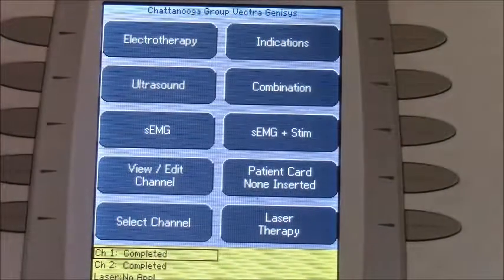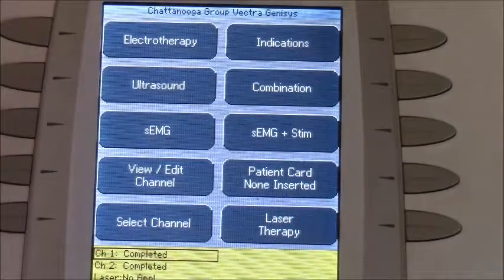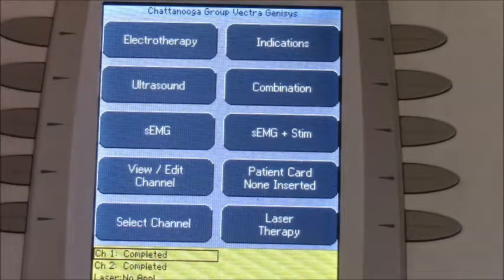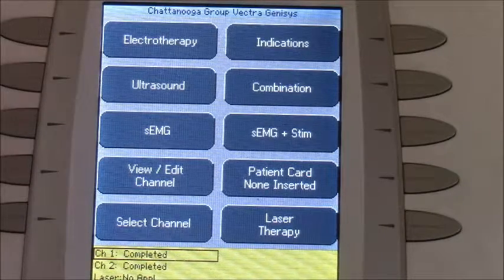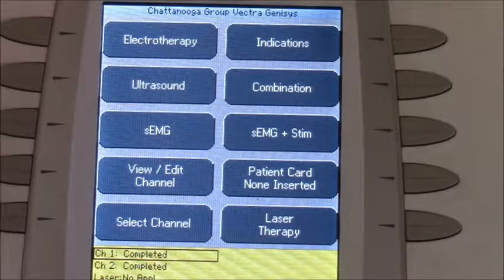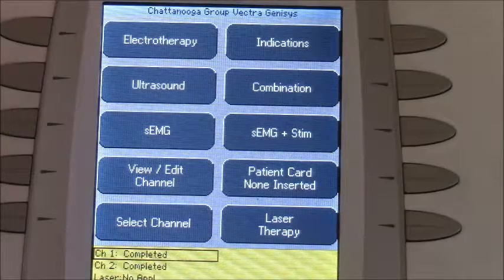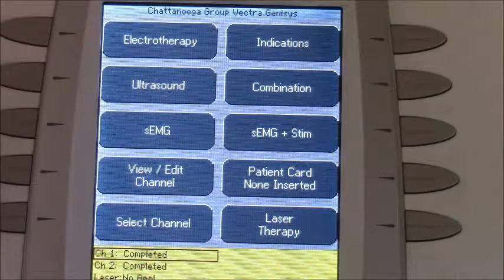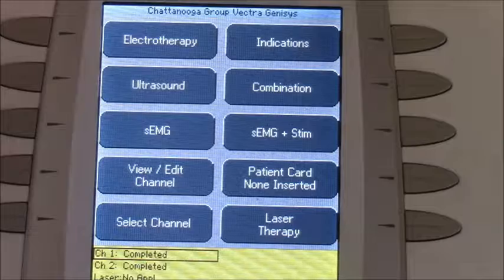Here we have a setup for electrostimulation, and specifically we're going to be looking at reciprocal contraction, which is using two channels or two leads coming out of the machine — one lead per muscle. Oftentimes it's agonist-antagonist, but it could certainly be set up for whatever application you're trying to accomplish.